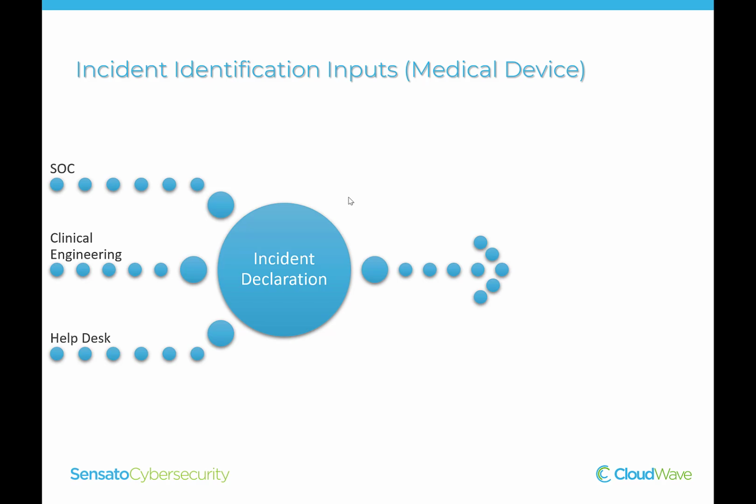it's going to come, especially when we're talking about medical devices, to clinical engineering, or biomed if you're calling it biomedical engineering. We're going to use the term clinical engineering. Or it may come to your help desk. And even though you may have very distinct protocols on how people are to raise incidents or report security issues, cybersecurity issues or cybersecurity incidents, ultimately the reality is these are the typical pathways.